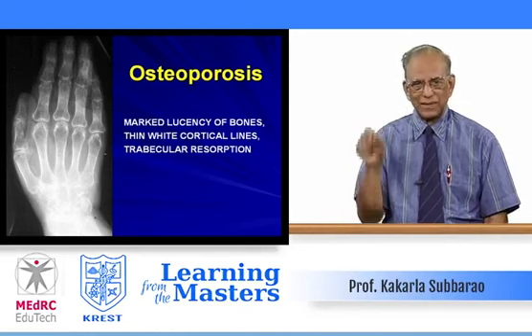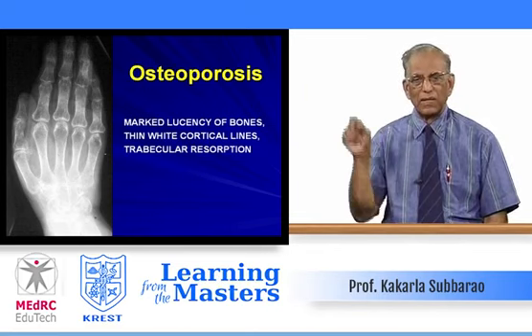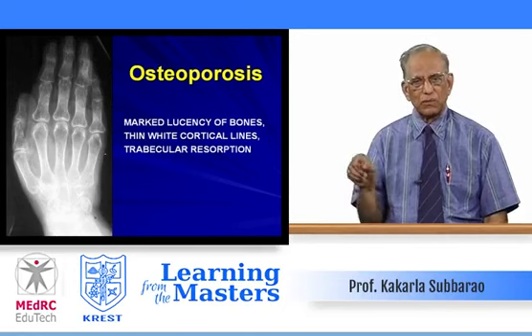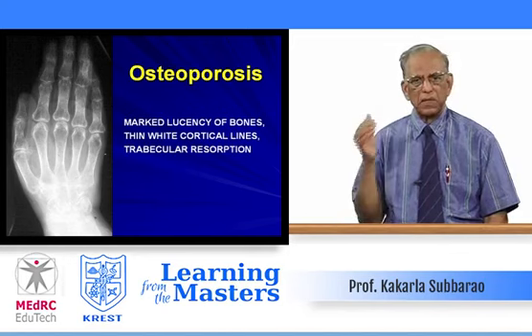The cortex is thinned but not absorbed. The cortex is thinned, whereas in the spongiosal bone, sometimes you see the exaggeration of the trabeculae early on. Eventually, there is no spongiosa, completely resolved. Phantom bone, they call it.